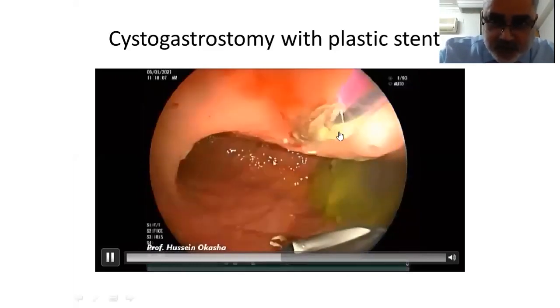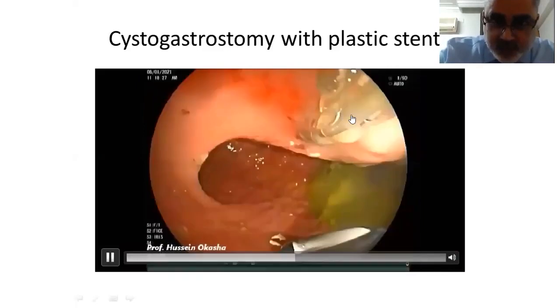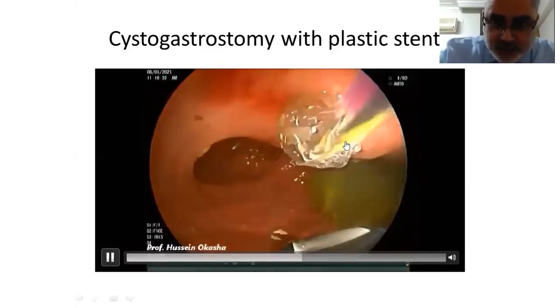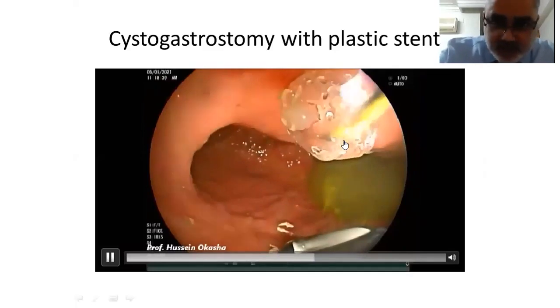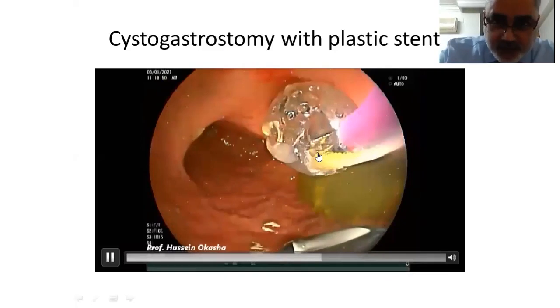And then we can shift now to the endoscopic view. This is the two markers of the CRE balloon. And we then can shift to the endoscopic view and then start to inflate the balloon. This is a 12 to 15 millimeter CRE balloon. And then we will inflate it gradually.